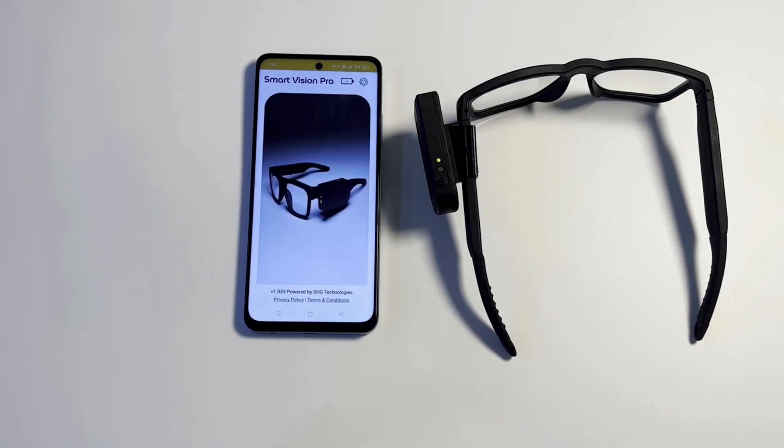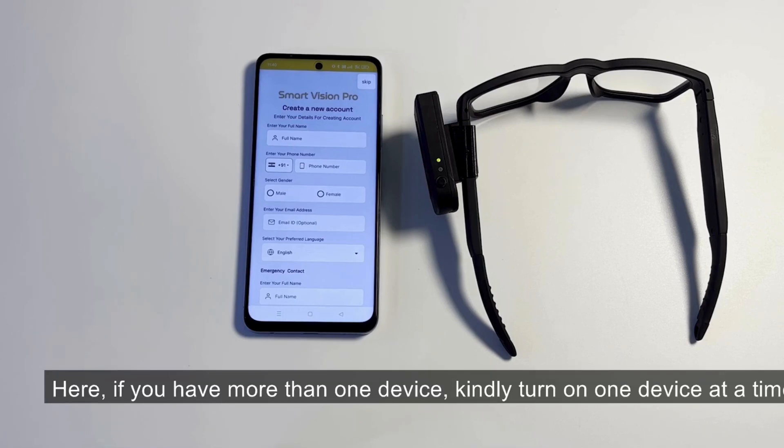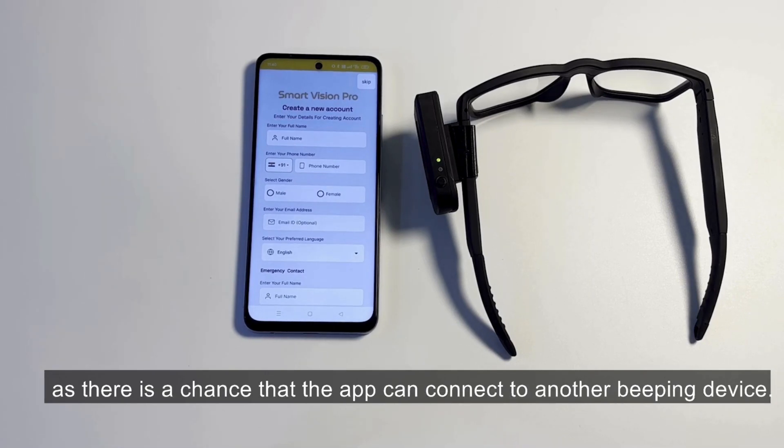Smart Vision Glasses connected successfully. Here, if you have more than one device, kindly turn on one device at a time, as there is a chance that the app can connect to another beeping device.